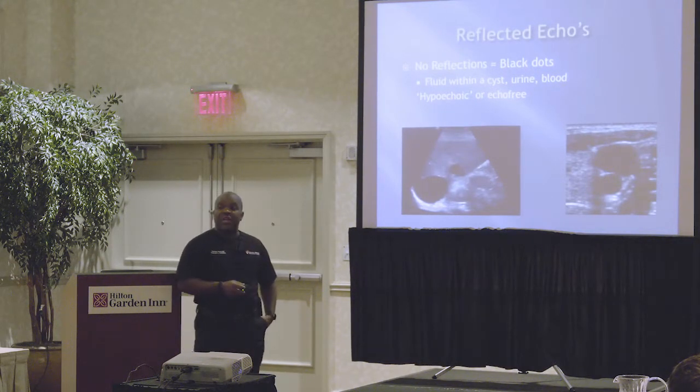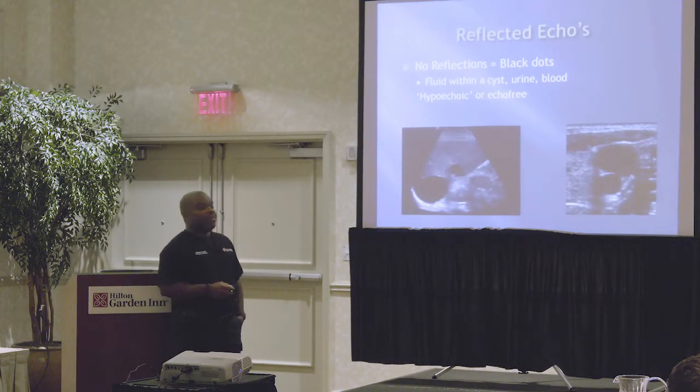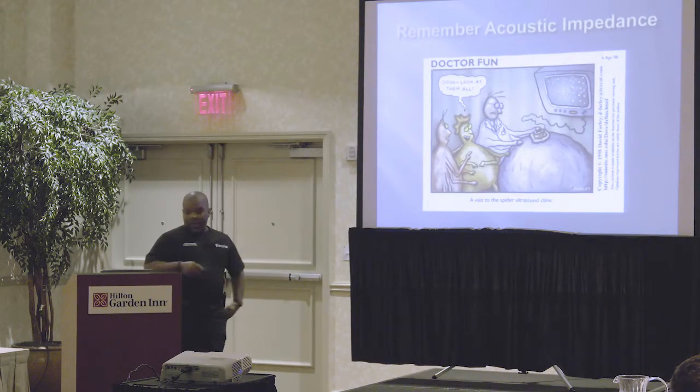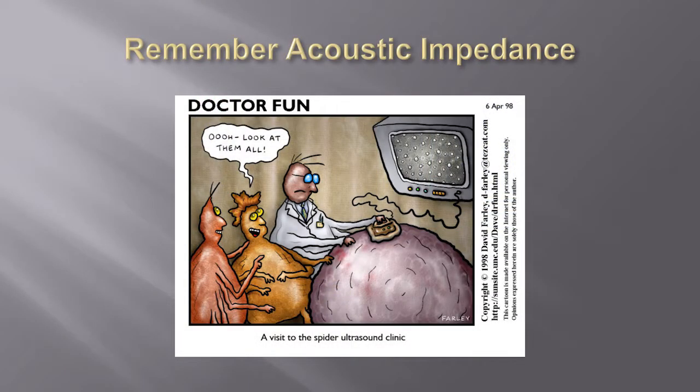Because if you're putting a central line in this patient, and you wanna do blind placement, we know most of the time our jugular lies side by side to the carotid, but in this patient, it does not. The jugular is on top. So if you didn't use the ultrasound, you'd put your needle all the way through into the carotid, and then you have to call the thoracic surgeon at 4 a.m. and get yelled at. Okay, moving along.